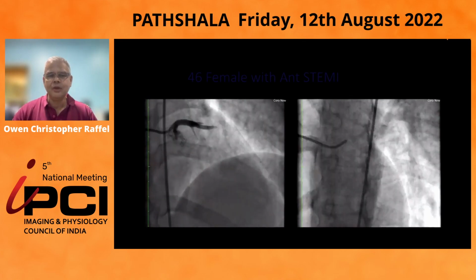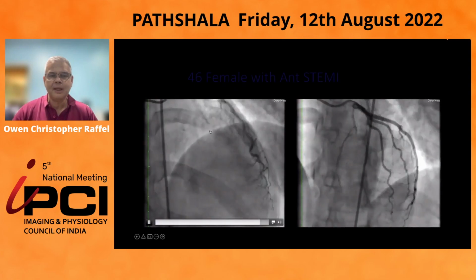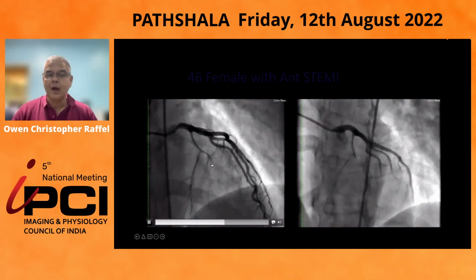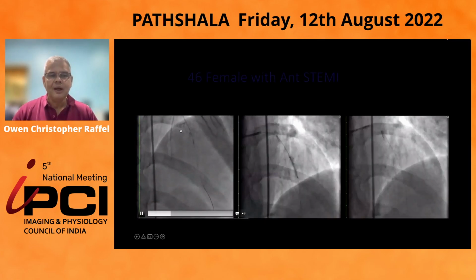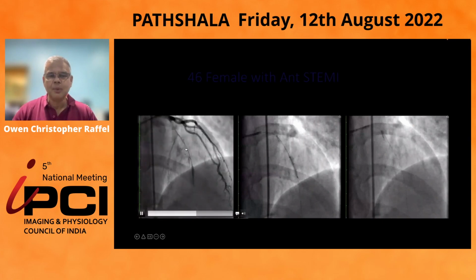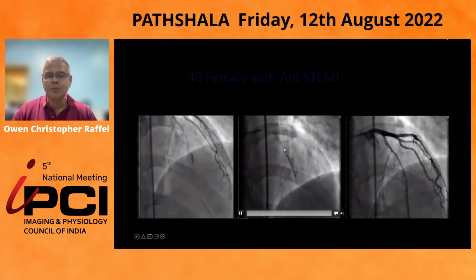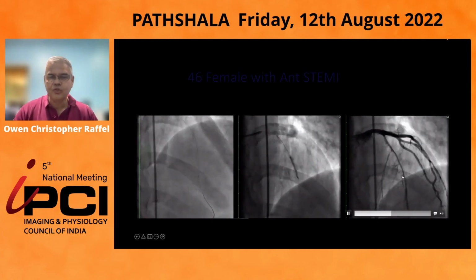These are the cranial views, which really tell the story. Here's an attenuated proximal LAD and a cutoff. This, to my eye, was type 4 SCAD, although one could argue maybe it could be an embolus as well. Needed to be treated, so we wired it, and you can see now the appearances more typical of SCAD. This is occlusive, so we did a gentle pre-dilatation with a long 20 millimeter 2.0 balloon, which is in fact pretty safe, enough really for us to do an OCT.